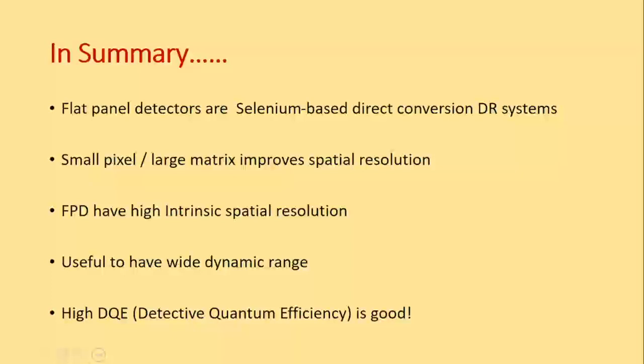All flat panels are. You should know that small pixels and large matrix improves the spatial resolution. FPDs have a high intrinsic spatial resolution. It's very useful to have wide dynamic range, and the high DQE is always good. That's what it's all about here.